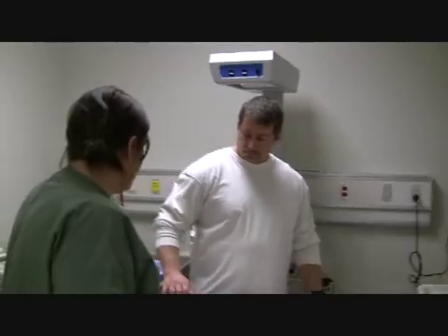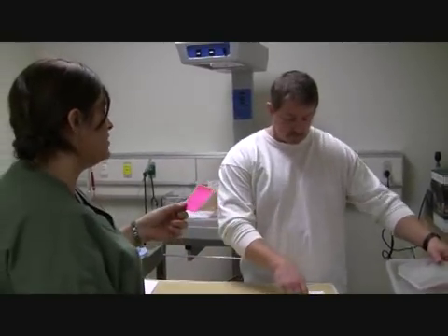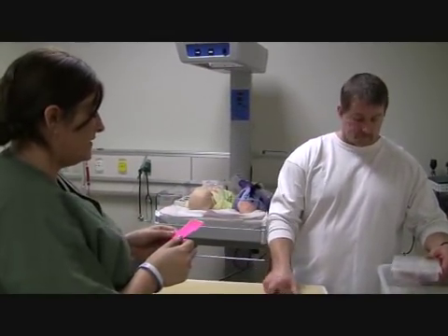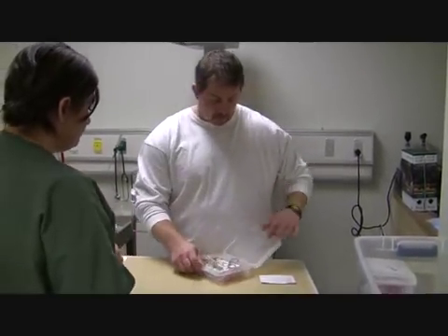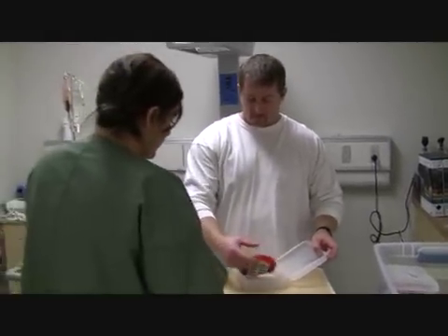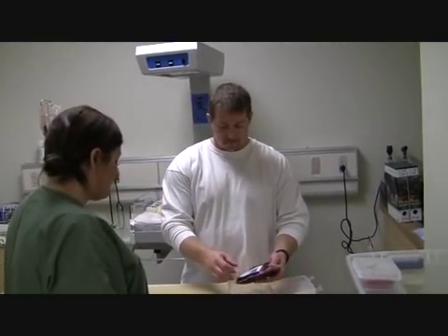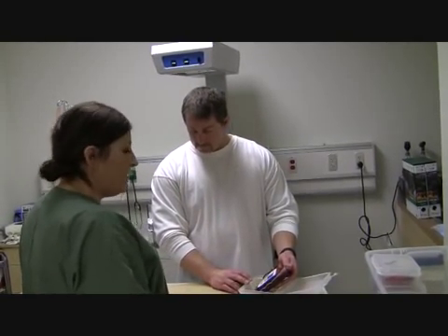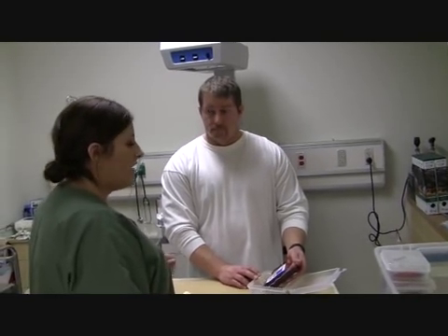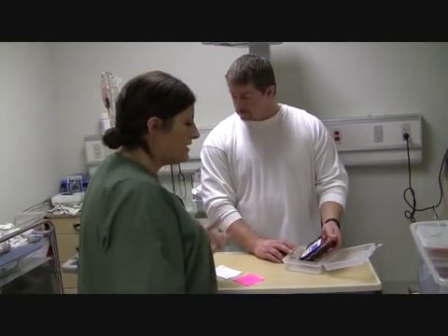So I'm coming into the lab to get the blood. Okay, I need blood for patient Jane Jones. She's AB negative. So we have Jane Jones. The lab's given me some blood. I need RH, anything that'll go with RH negative or AB negative. So I could give A negative, B negative, or O negative, or AB negative. So anything as long as it's RH negative.